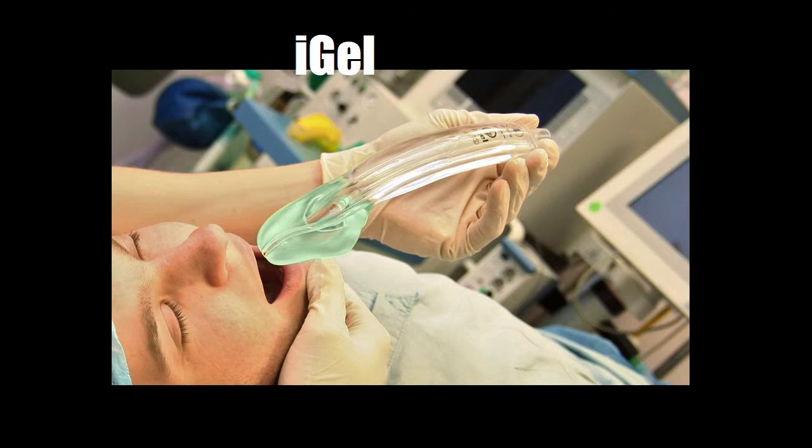Have you got the gear for the awake? So the gear for the awake in terms of the anaesthetic, what we'd use in theatre and what various other emergency people suggest is 4% lignocaine, as opposed to here we've got 10% lignocaine, which you need to dilute, and it's in a sort of sealed, pressurised jobby. But it's just 4% aqueous xylocaine, it's called, and you put that through the easy spray, and you spray everything inside, and then you try and spray the cords, which we don't have currently, but it's easy to get. They've got it in theatre. The actual spraying thing? The nozzles. It's the extension part. Usually the device is an atomizer. The actual long bit that attaches to the syringe we don't have.